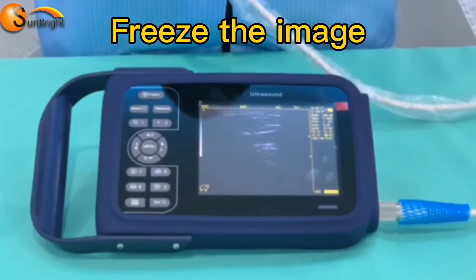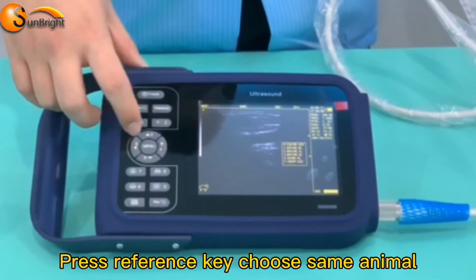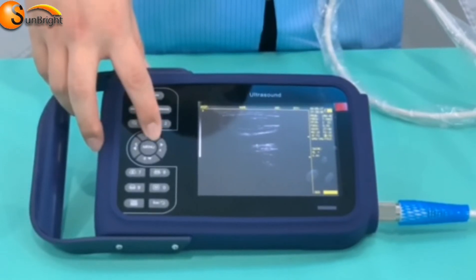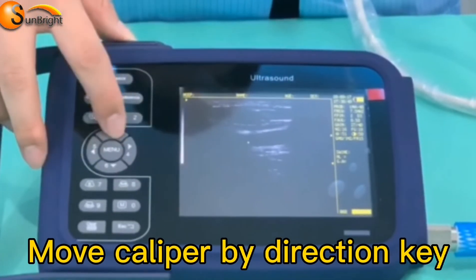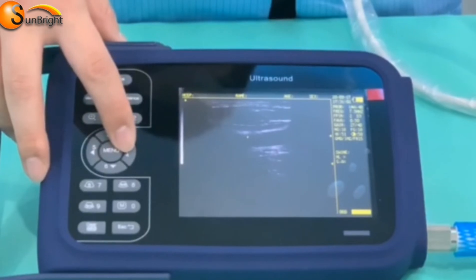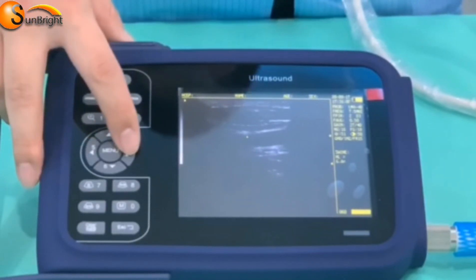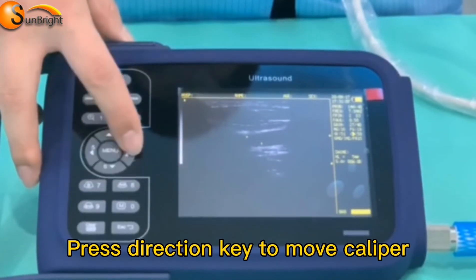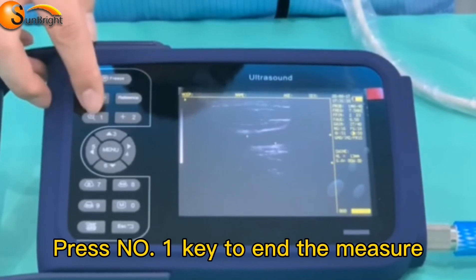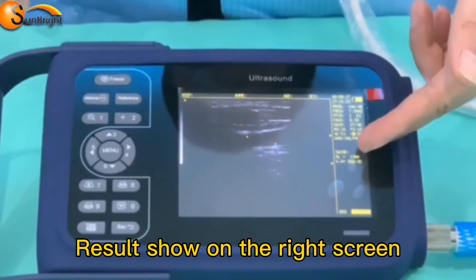Press the image key, then press Reference to choose the same animal type. Press number two to generate a caliper display on the screen. Move the caliper to the start point using the direction keys three, four, five, and six. Press Measure to confirm the starting point, then press the direction key to move the caliper. There will be a dotted line while moving. Press number one to end the measurement, and the distance result will be displayed on the right side of the screen.